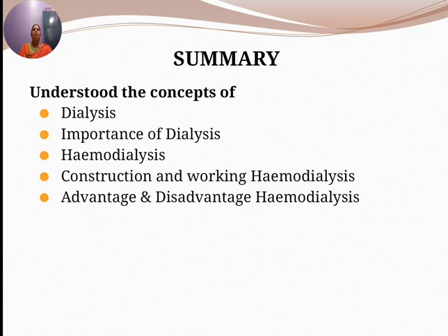So the hemodialysis machine performs 5 basic functions. What does it do? It mixes the dialysate, it monitors the dialysate, it pumps the blood and controls administration of anticoagulants, then monitors the blood for presence of air and drip chamber pressures, and monitors the ultrafiltration rate.